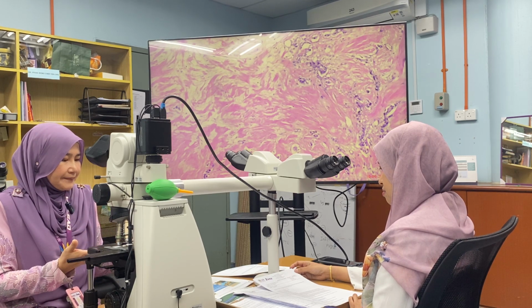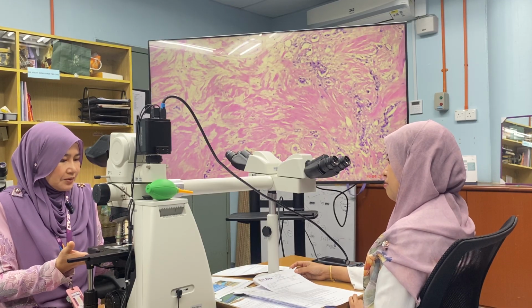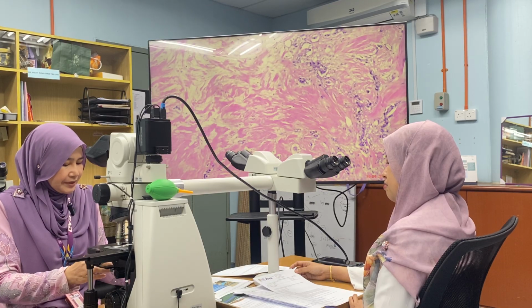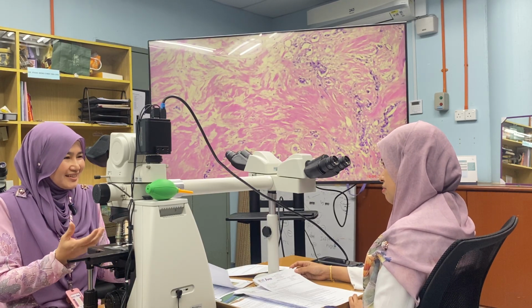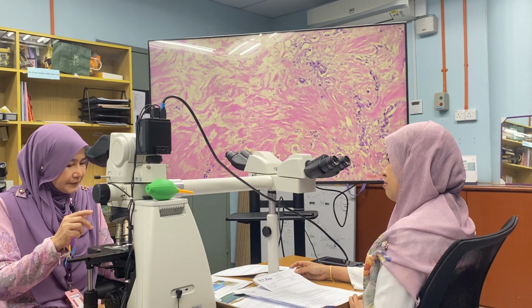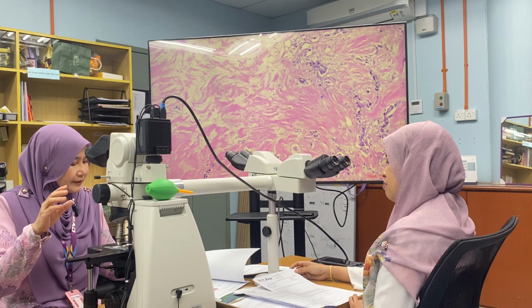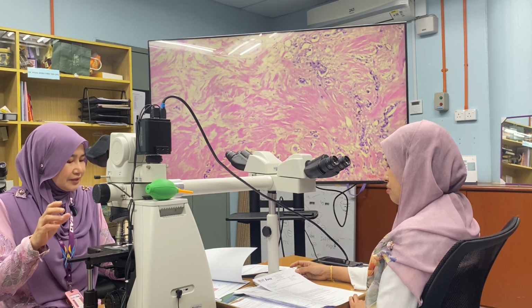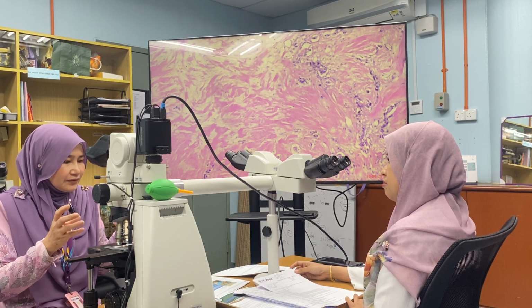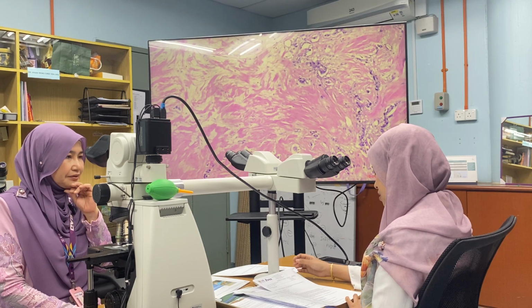These are the things that you missed. And then for the tumor pathologic response, you need to describe well what their appearance is. Sometimes the tumor becomes concentric. Sometimes the tumor becomes small, or we call it scattered foci. Scattered foci, concentric shrinkage of the tumor. You need to mention that in your report.